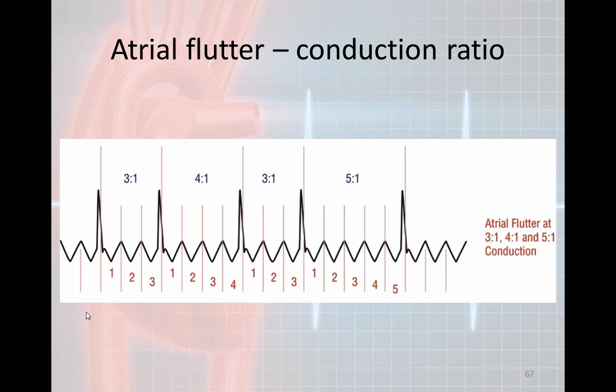So you draw a line through the peak, and then count the troughs.